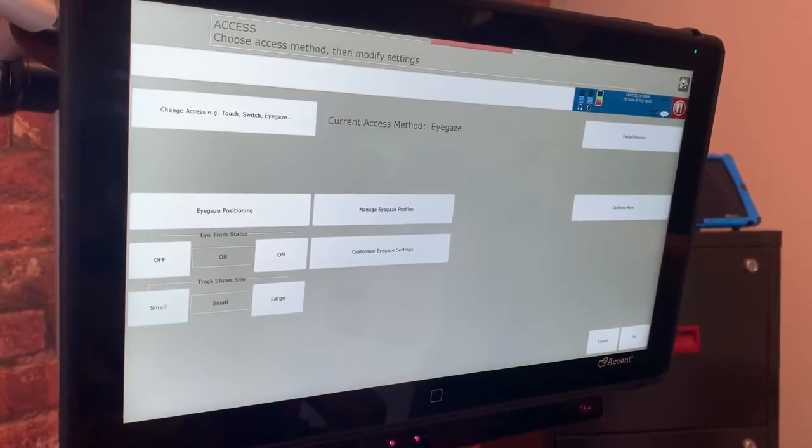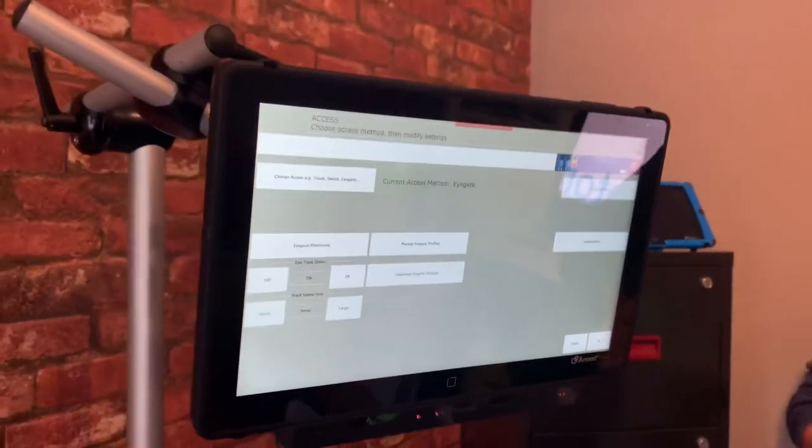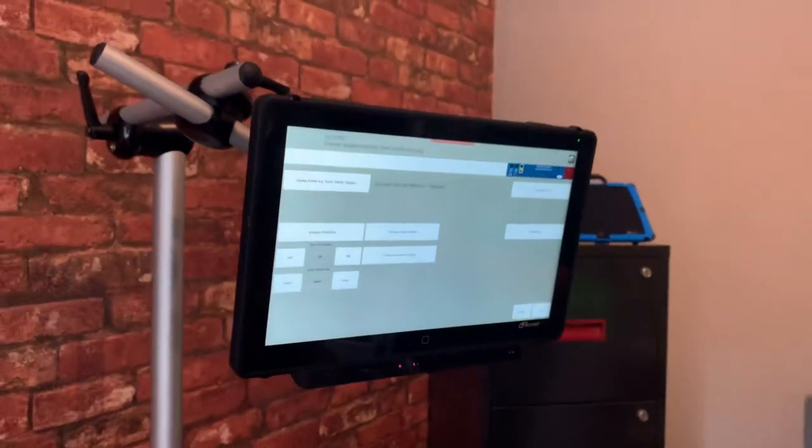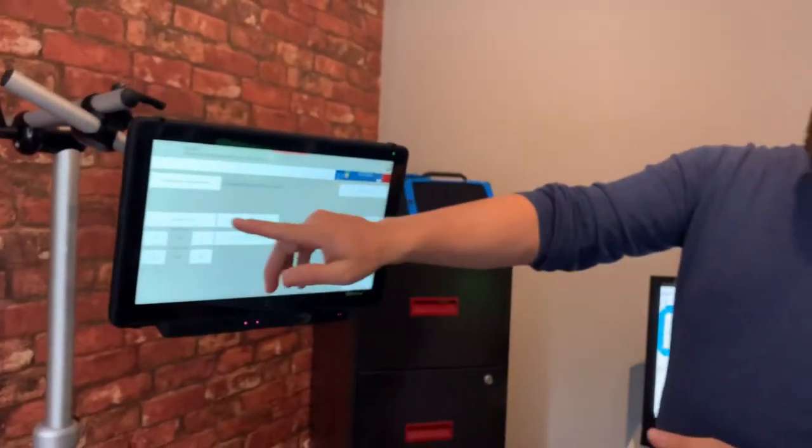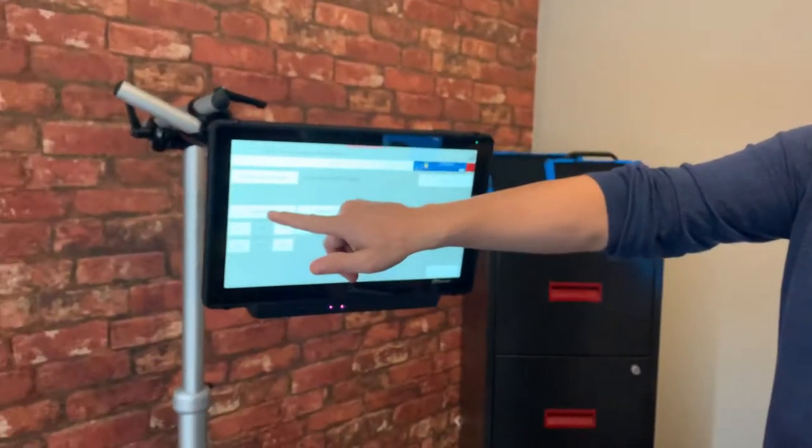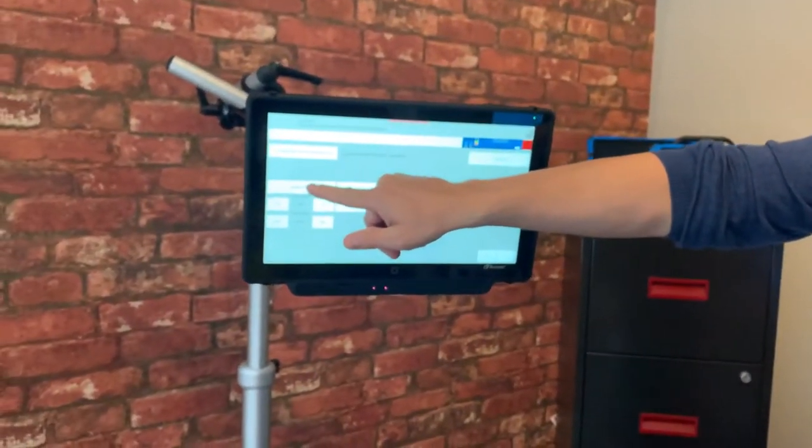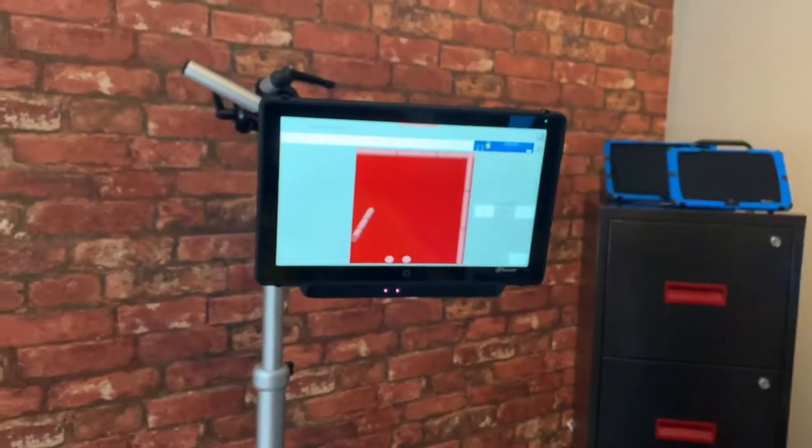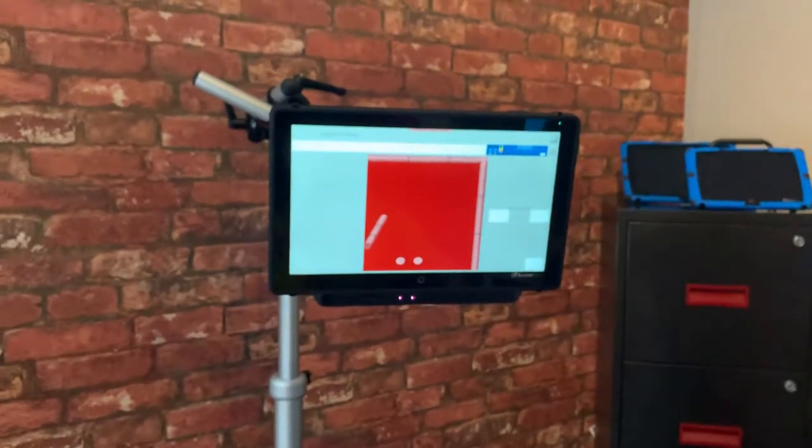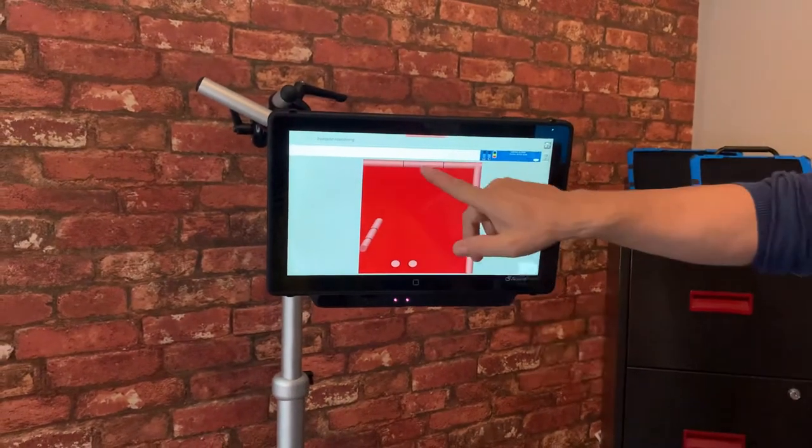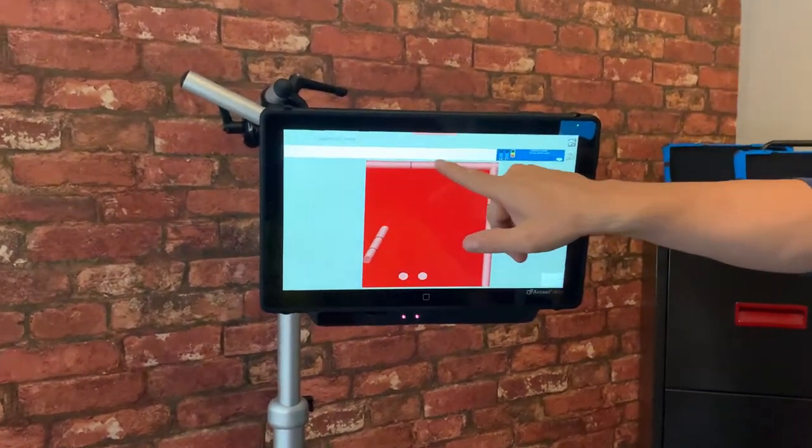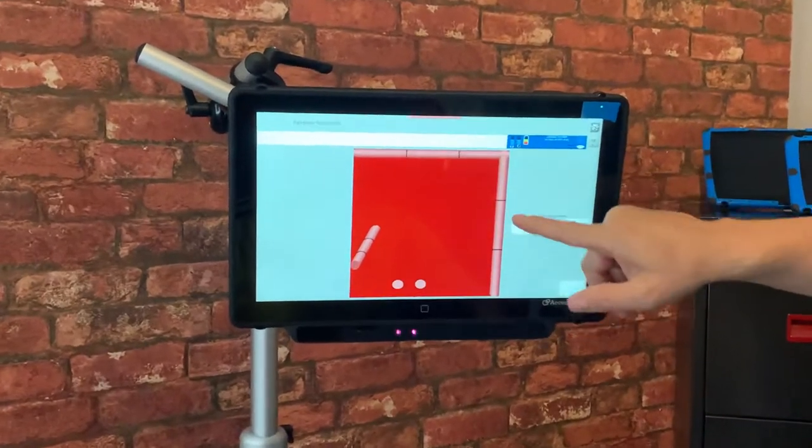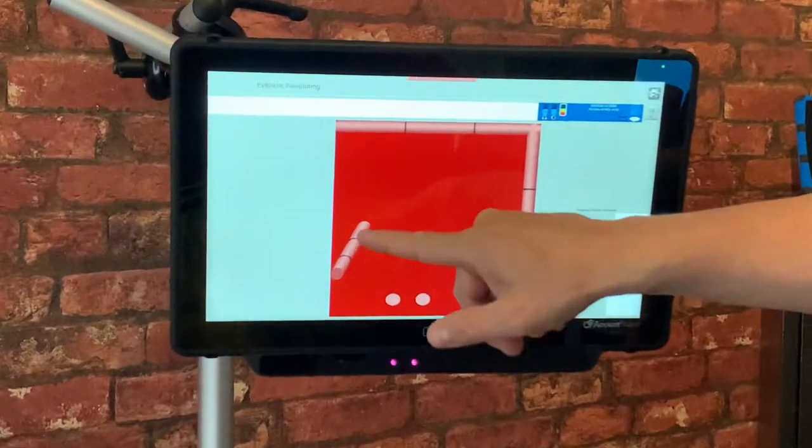Now the first thing I want to do when we're looking at Eye Gaze is look at the position of the client and I do this by going into the Eye Gaze positioning and here this gives me a window and shows me where the client is. Now I'm looking for dots to appear in the top here, in the side and also here.